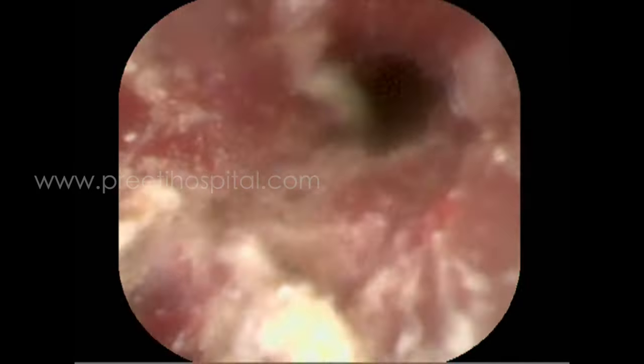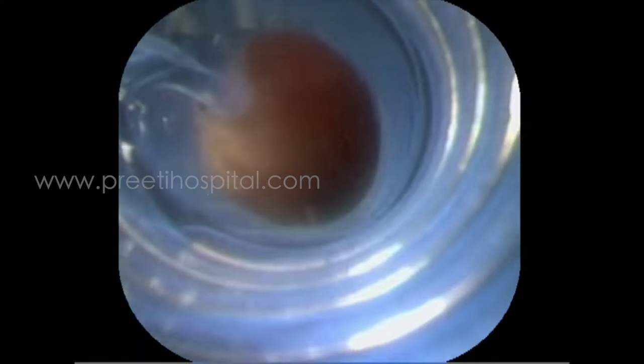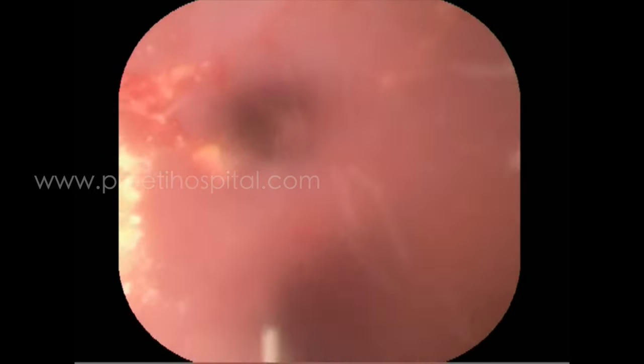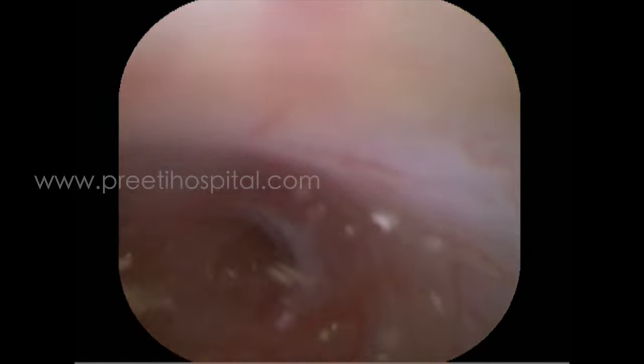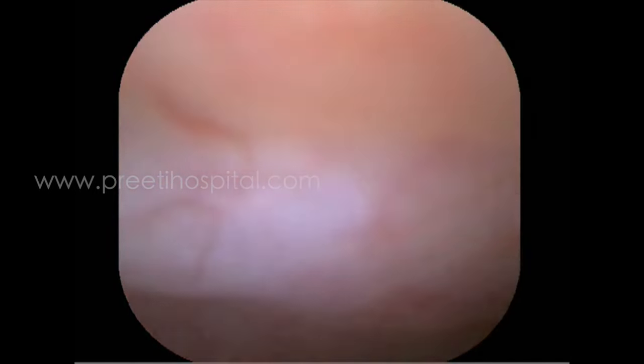I personally feel, as of now, this flexible and navigable access sheath is more useful if the ureter is accommodable very well to the 10 by 12 sheath, and if you can see all these stones and pulverize them into small fragments, they can be easily sucked out. All the powder which has gone into the other calyces can also be sucked out, so that by visual inspection we can clear the entire PCS, and then the stone free rate will be much better. Intrarenal pressure rise and small fragment retention are the two major disadvantages of RIRS; they will be slightly reduced.